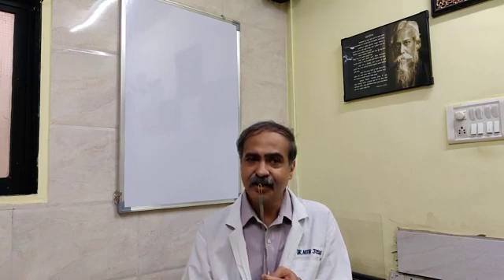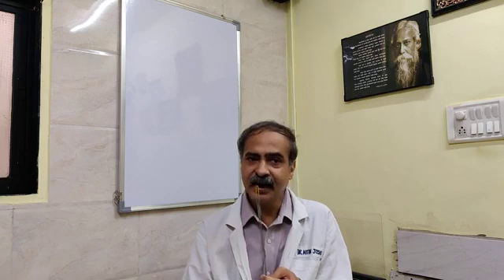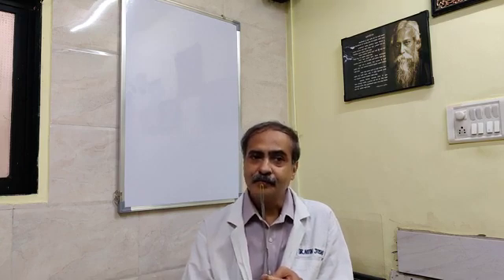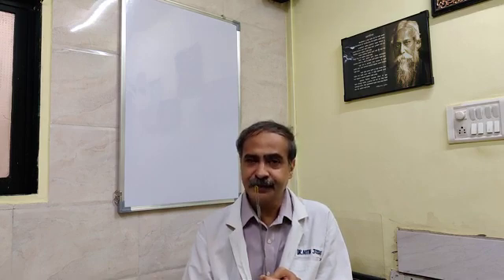Because of incision of adenomatous tissue, the bladder neck will start opening and gradually you will start reaching the capsule. However, don't incise the capsule, because just below the capsule are large voluminous periprostatic venous sinuses, and it will result in extensive venous bleeding. You have to take the incision from bladder neck to veru.